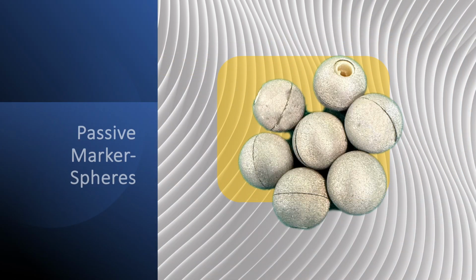Passive marker spheres are typically placed on the reference frame, and navlocks are attached to surgical instruments. These markers provide the navigation system with real-time positional data. The spheres are detected by external cameras or sensors, allowing the system to track the position of instruments, tools, or the patient's anatomy during surgery. However, the presence of blood or erosions can interfere with the function of the spheres. A minimum of 3 visible markers on any navigable instrument is required for detection by the navigation system.